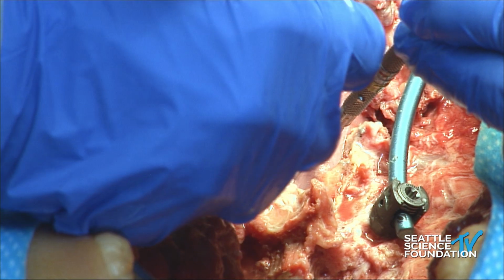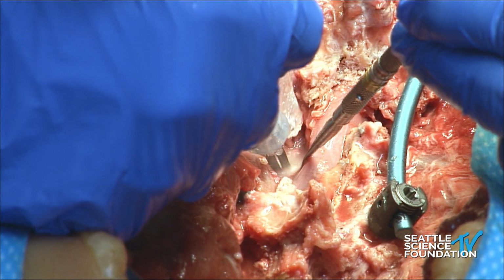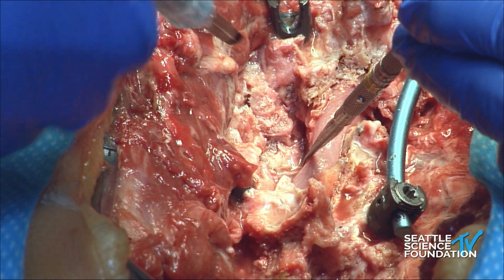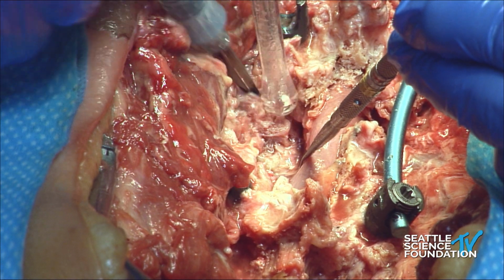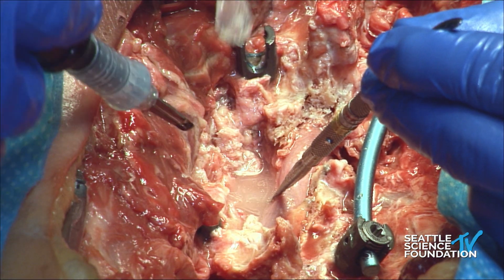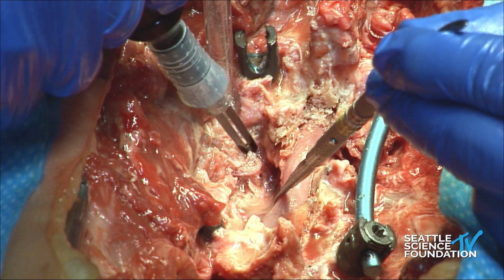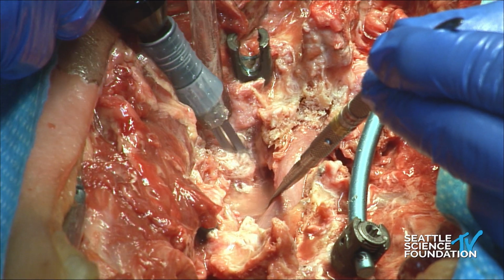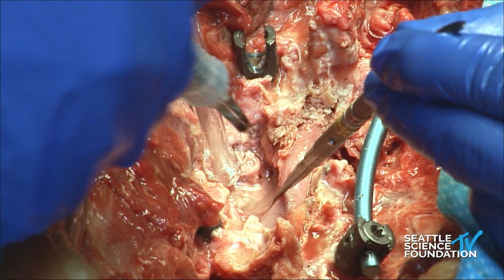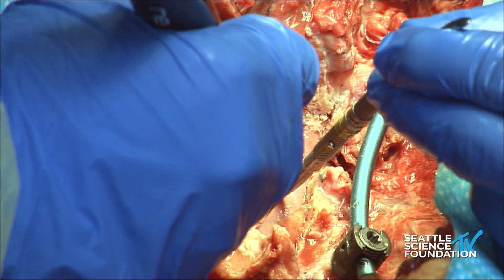So we're going to make this here. Start cutting the body. And then we're going to separate the pedicle out, and then this cut's going to come above the pedicle here. So we're going to dissect out to find this nerve root as well. I have a special L osteotome that fits right. This will go right inside, top down to the disc there. And then just to make it easier, we're going to take this part out right now.